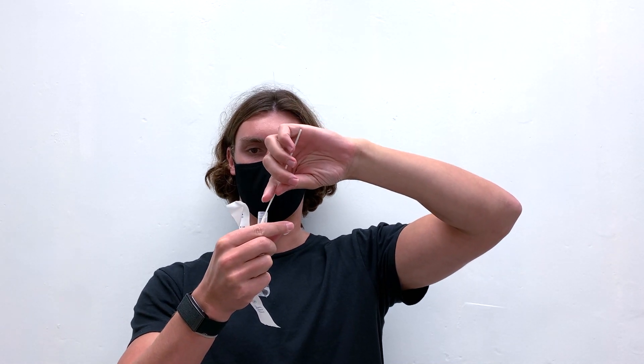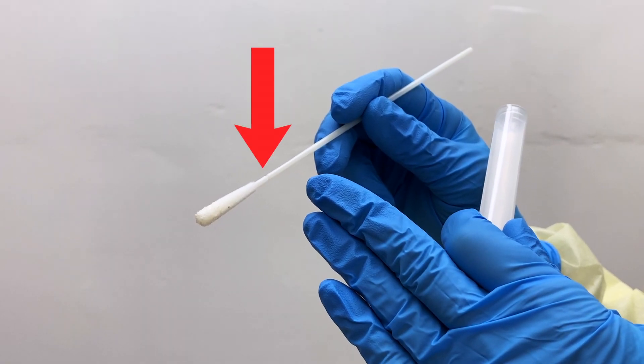This should last for a total of 15 seconds. Repeat on the other nostril. Once you've finished swabbing yourself, remove the cap and insert the Q-tip first, then break it at the break point.